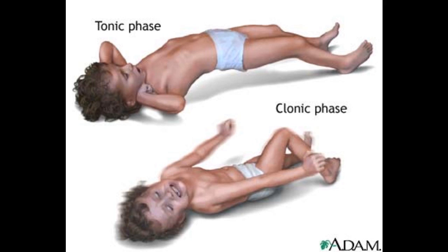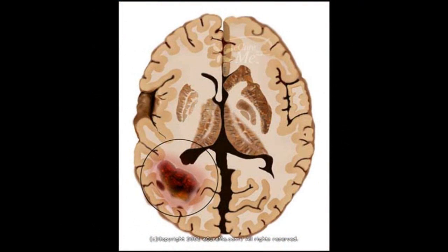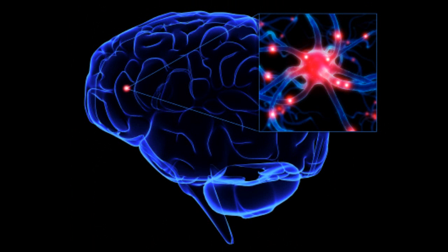The most common reason an EEG is performed is to diagnose and monitor seizure disorders. EEGs can also help to identify causes of other problems such as sleep disorders, brain tumors, abscess, intracranial hemorrhage, and other changes in behavior. EEGs may also assist in determination of brain death. EEGs are sometimes used to evaluate brain activity after a severe head injury or before heart or liver transplantation.